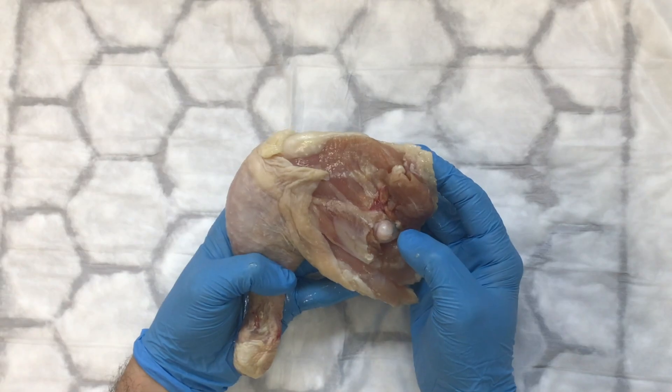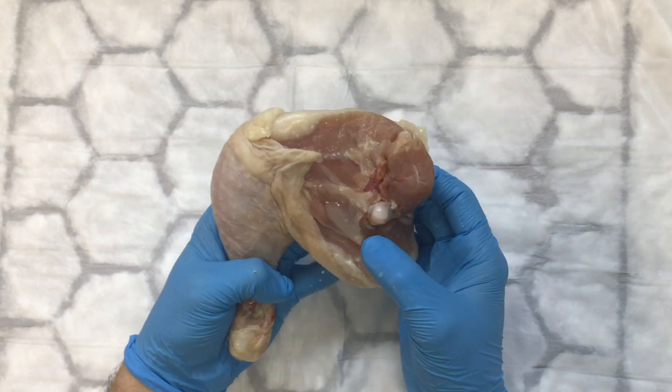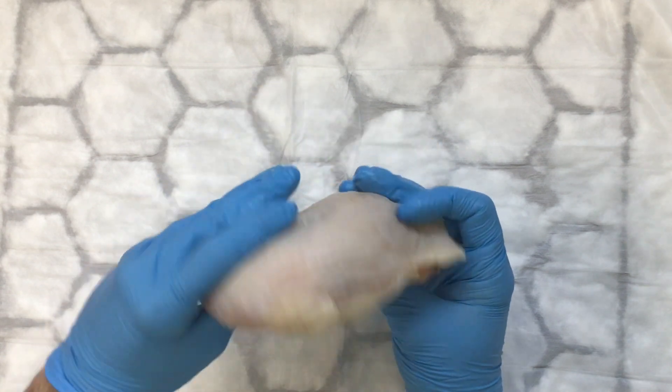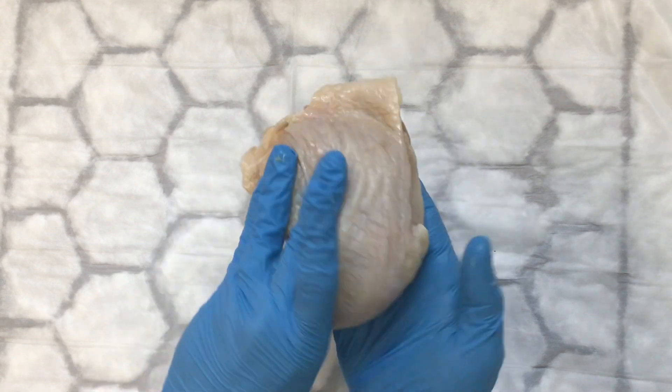This is a quick tutorial about how to use chicken thighs to do simulated microsurgery training. We've got the chicken thigh and we're going to prepare it. Normally the best way to do this is to go to the inner side of the thigh.